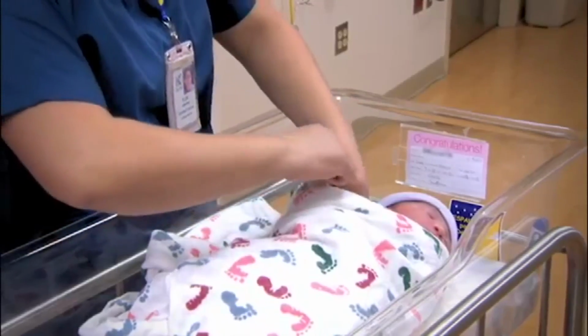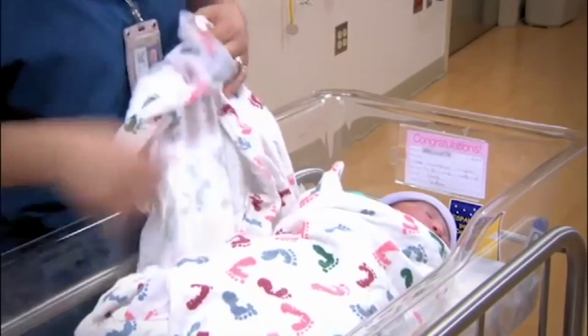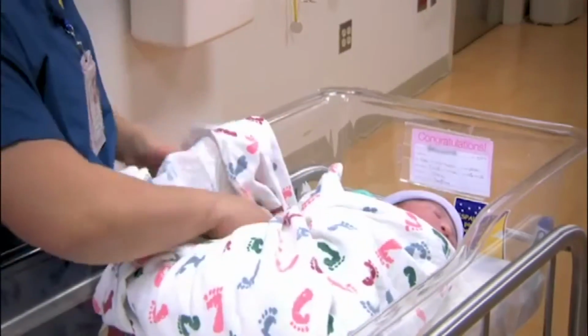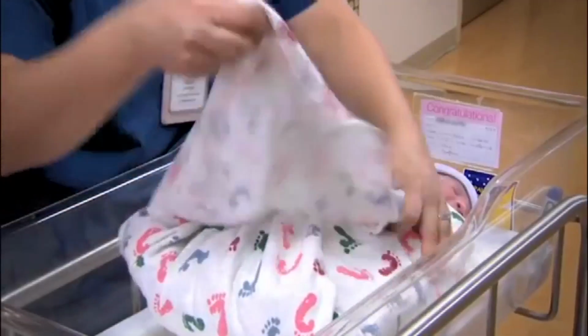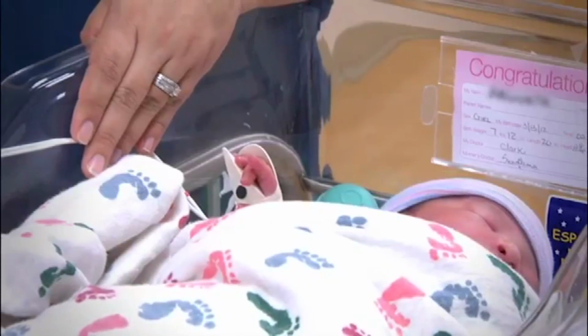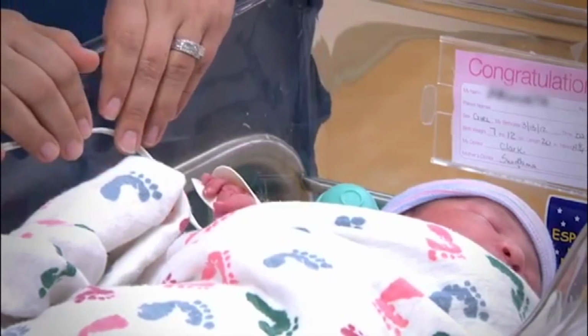If the baby is moving, shivering, crying, or in a deep sleep, the accuracy of the reading may be affected. Swaddling the baby and having a parent calm and warm the baby during the reading can help. You still want the baby to be awake if at all possible.